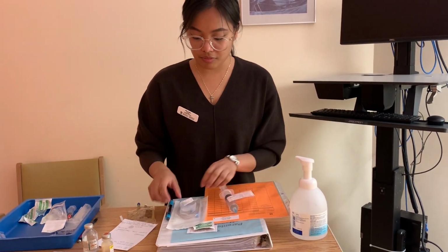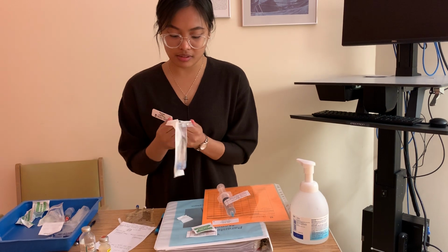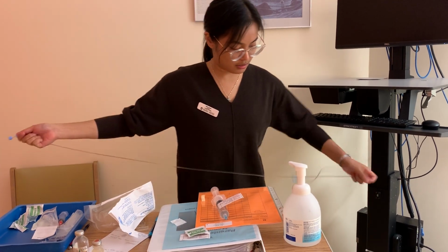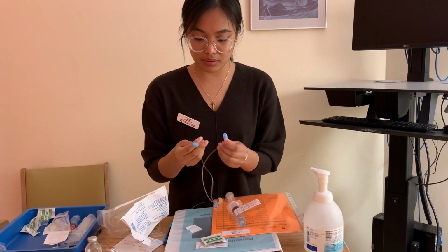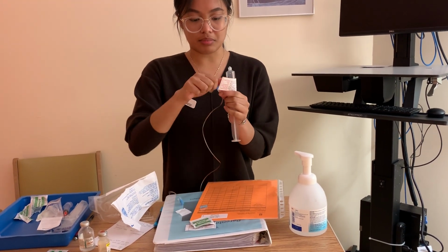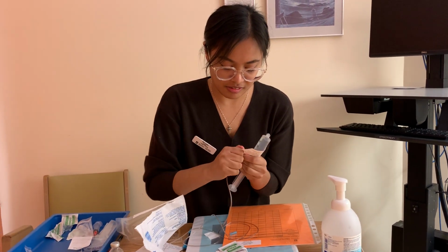So I'm going to very carefully do sterile technique. I'm going to make sure I'm not touching the ends of my cords and everything. So I'm going to unwind this. Okay, and then this is the port I want to attach it to. So I'm going to take out my blue cap, and first I'm going to forward prime. I'm not touching this. It's a little tricky.